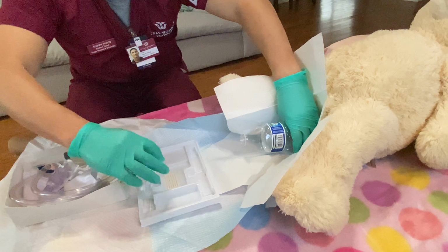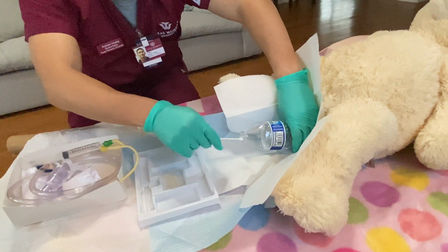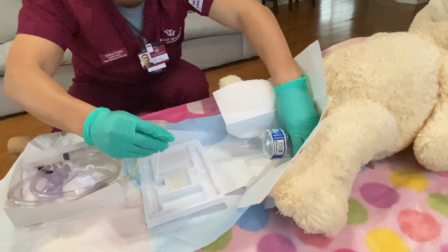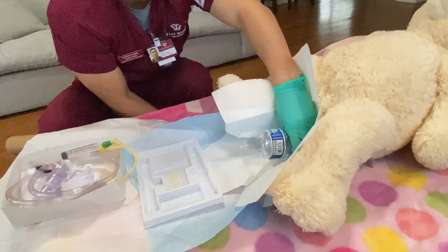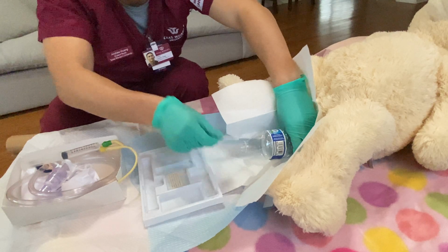And I'm going to grab a cotton swab and swab the iodine. And I'm going to clean the meatus and then go in the circular direction outwards. I'm going to do the same and repeat. Dip the cotton swab in the iodine, clean the meatus in the circular outward motion. And on the third one. Okay.